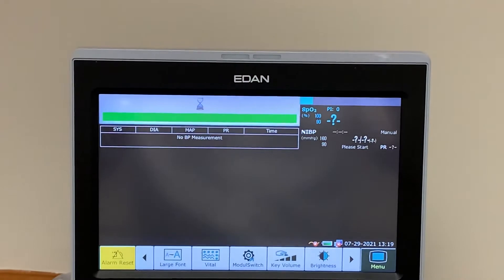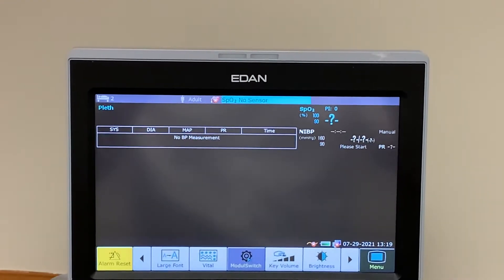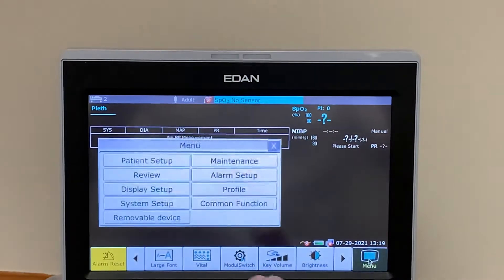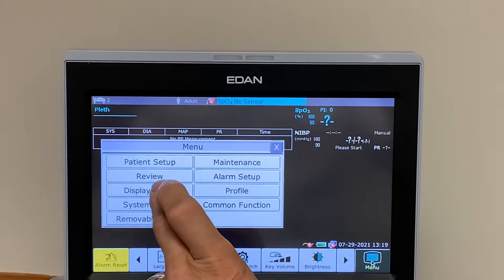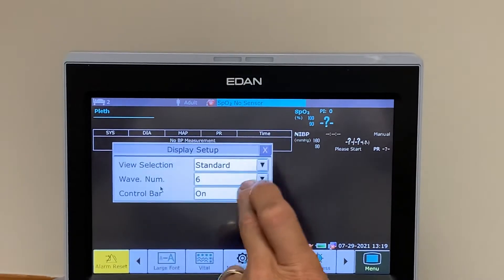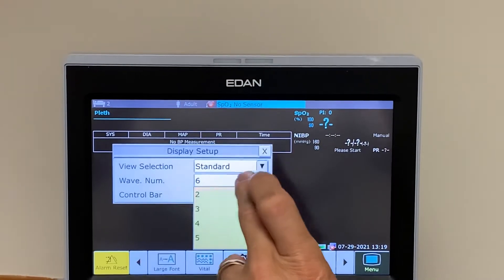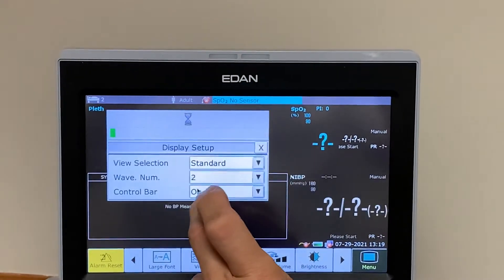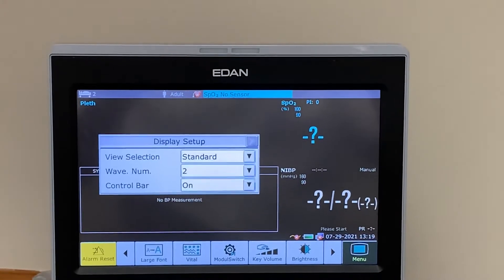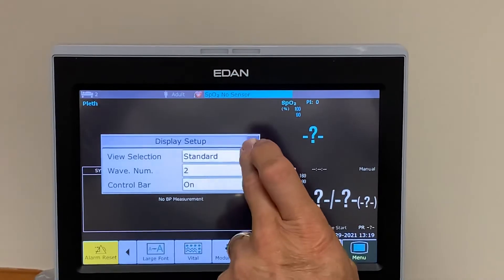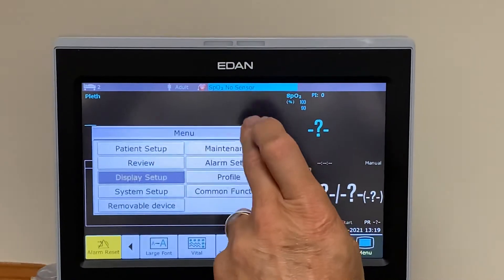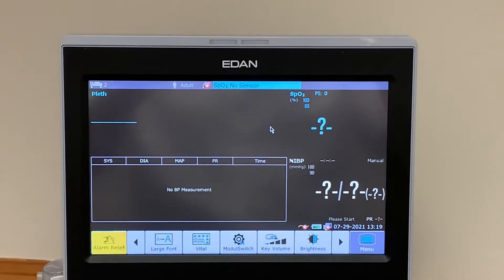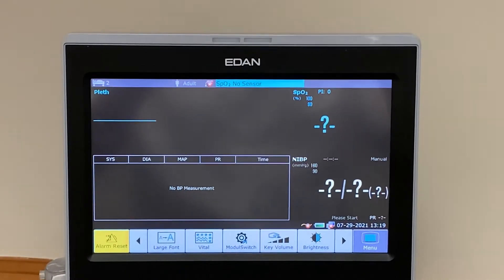The monitor will reconfigure itself. Now we need to press the menu button to go into Display Setup and change the number of waveforms from 6 to 2. We now have what is essentially a spot check monitor.